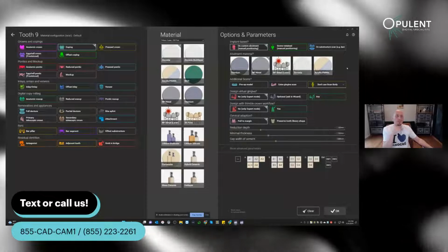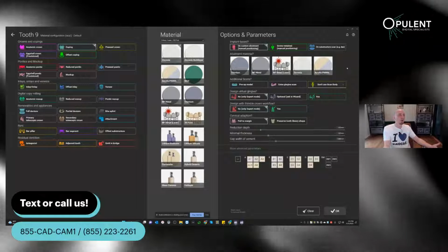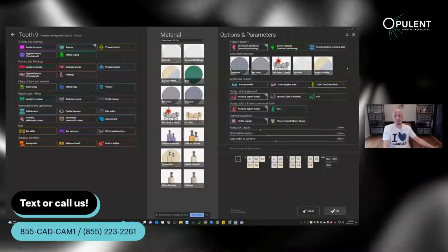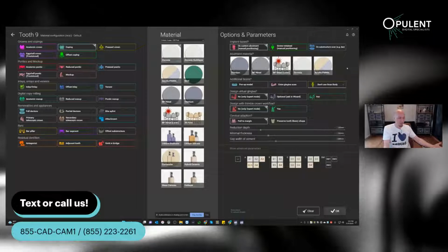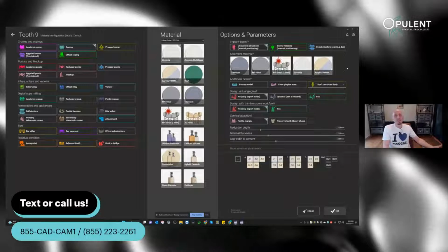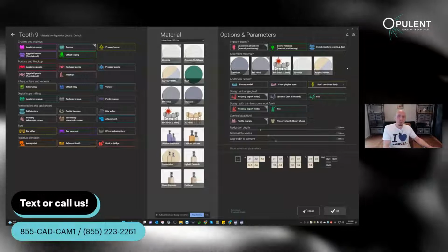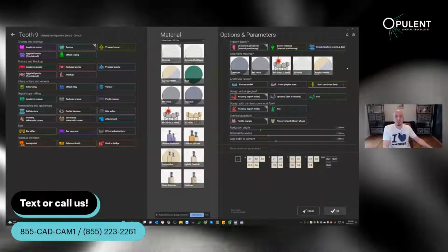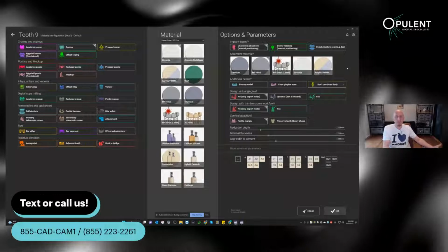You think you are doing everything right, you're making your homework, you're looking into, does my doctor have the correct scan body? Maybe you're even providing scan bodies. I've heard some people doing that, scan bodies to your doctor to make sure that they're using the right kind, and that your life is going to be easier. And don't misunderstand me. I would always recommend you to use a scan body if you have the option to do that. It's just more accurate, it's easier, it works out of the box.